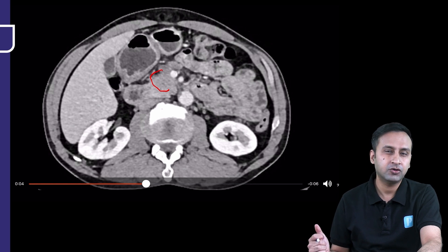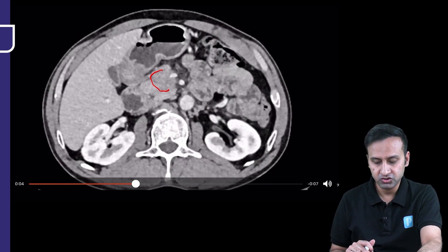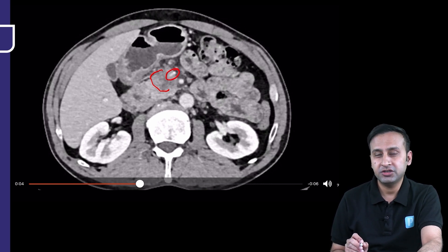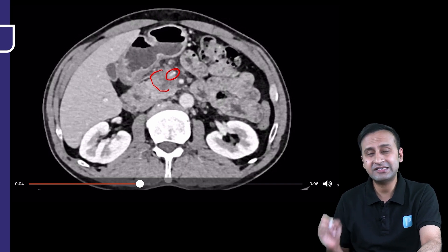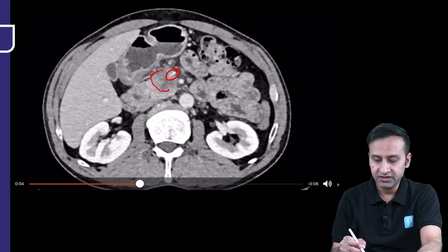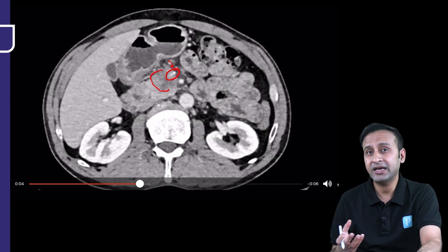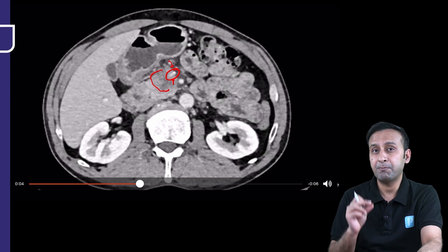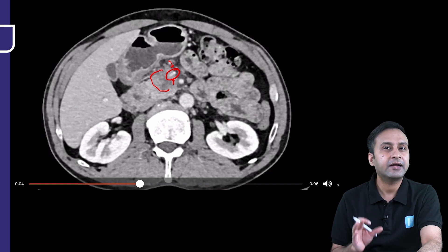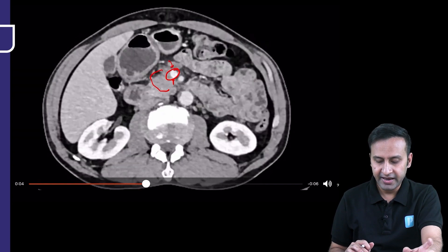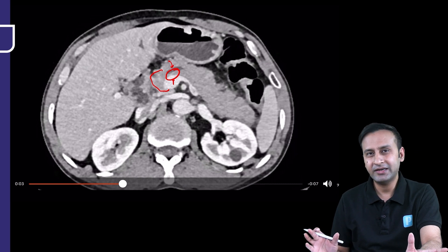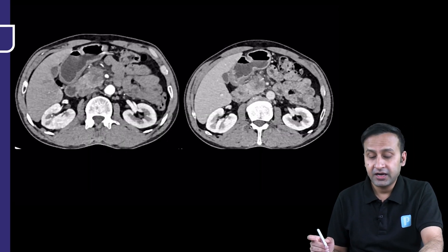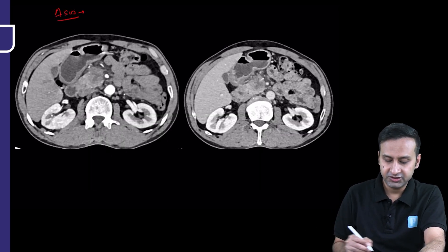First, pancreatic adenocarcinomas will be hypo-enhancing like this. Second, look at the vascular encasement — in mass-forming pancreatitis you won't have vascular invasion. Only typical pancreatic adenocarcinomas can cause compression, encasement, vascular narrowing, and irregularity of the vessel wall. Because we can see the SMV has been compressed by this lesion, we're talking about a case of pancreatic malignancy. The prima facie diagnosis is quite clear — we've answered the first part of the question.